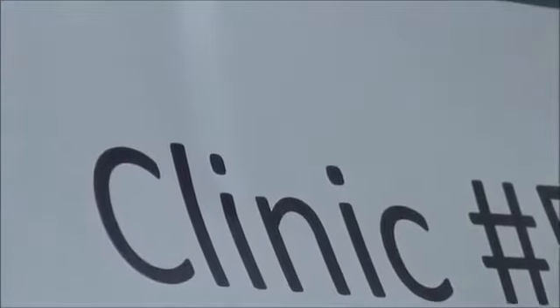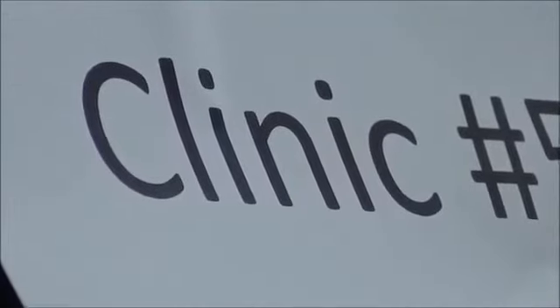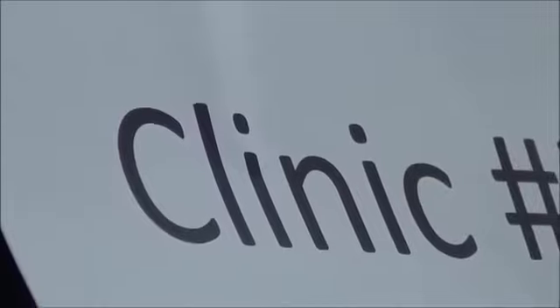RPD. And I hope your patient goes out happily, and they might come in later on for a recall visit if they have any complaints to be treated on the spot, similar to complete denture procedure.